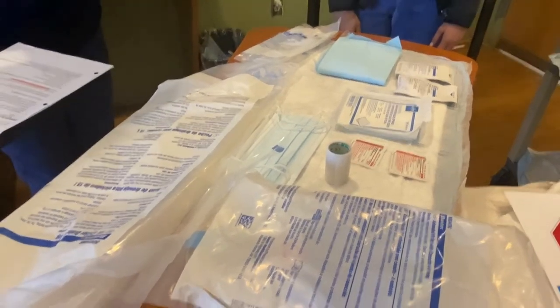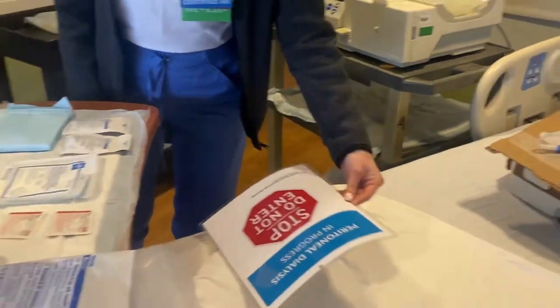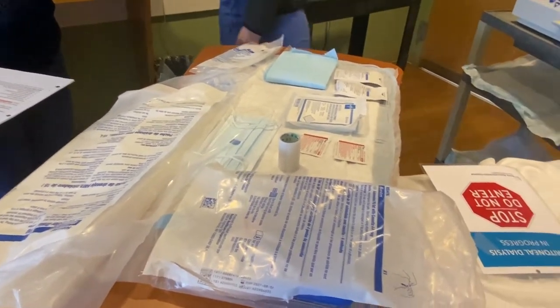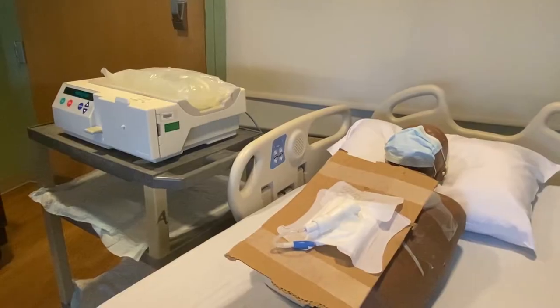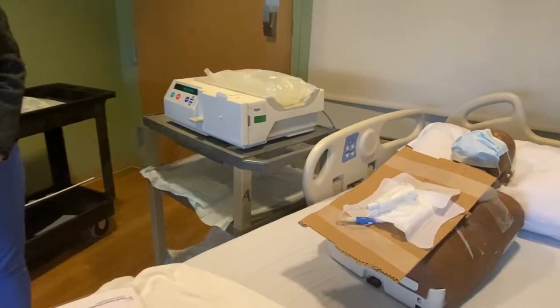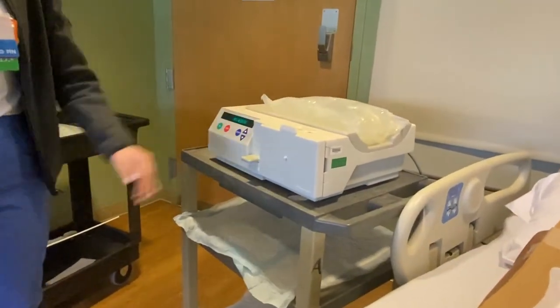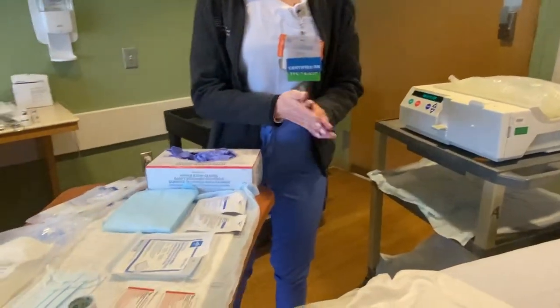Give report to the covering RN. Place a sign on the door: do not enter. Obtain patient weight and vital signs. Ensure that the air from the vents is shut off. If the patient is in a semi-private room, close the curtains. Ensure all supplies needed are at the bedside and ready for setup. Make sure your fluid has been warming for half an hour prior. Perform the one-minute hand wash and apply clean gloves.